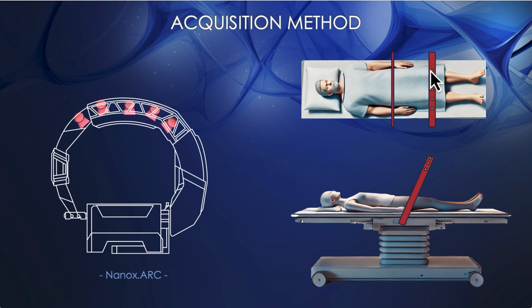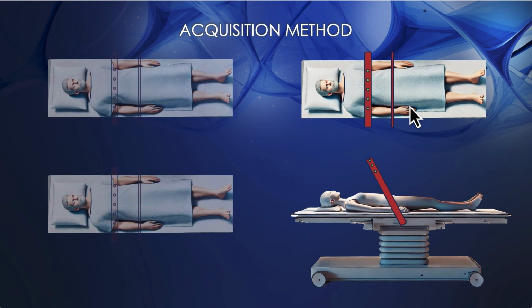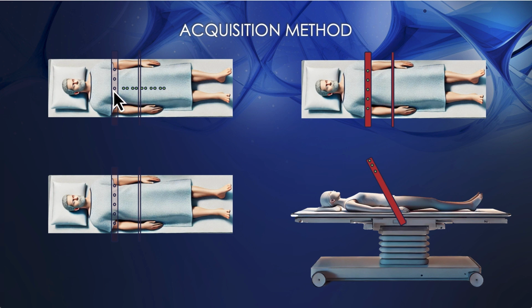The way it works is the tubes are again indicated in green dots here on this arc that goes over the patient, and when you acquire all your projections, this arc essentially tilts above the patient. While it's doing that, it is acquiring images in a variety of projection strategies. One is a linear projection strategy, where there are a series of images acquired along a line using only the central source. This is very similar to the type of digital tomosynthesis instruments that we are used to.